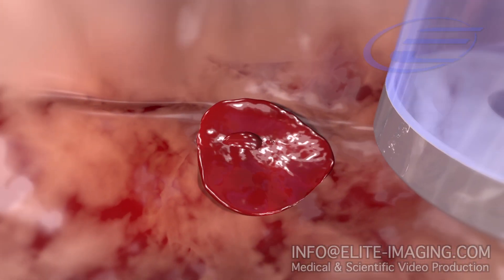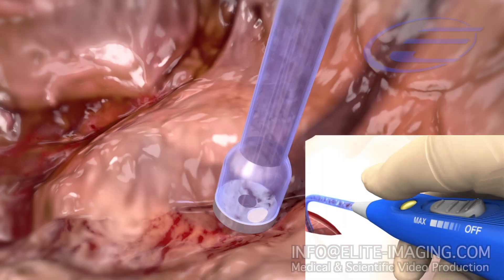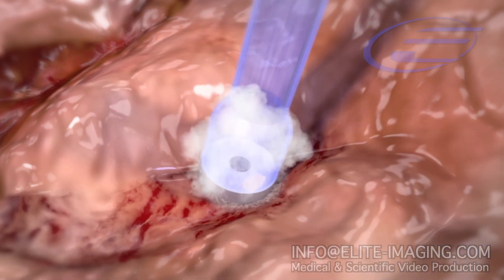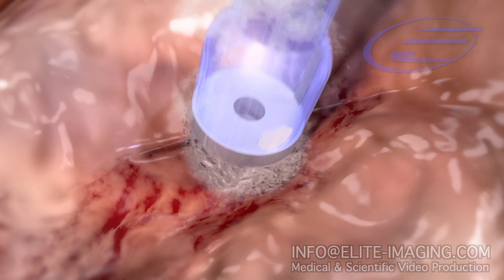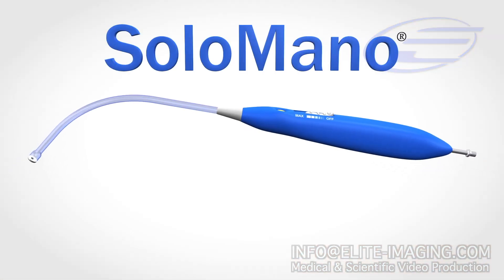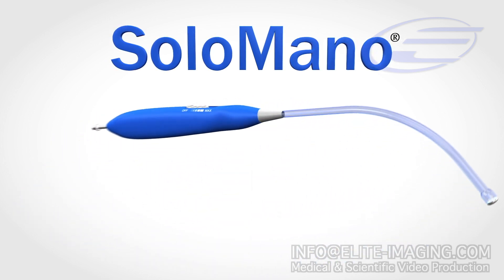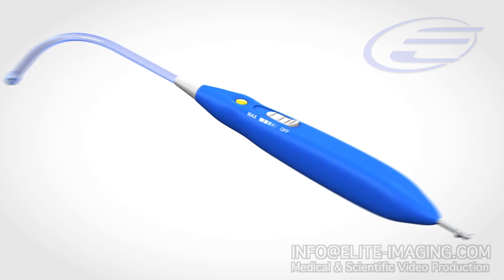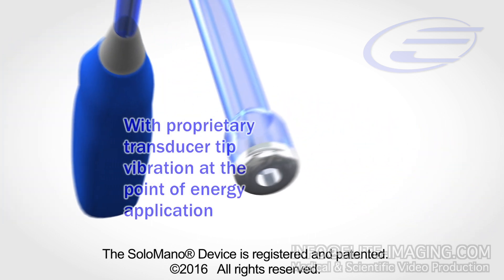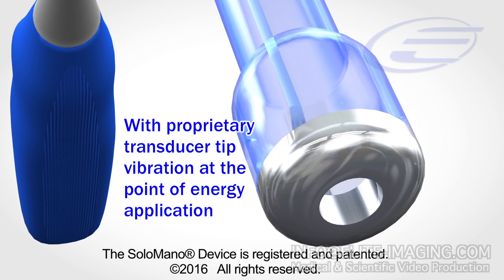The SoloMano transducer tip simultaneously applies energy and micro-motion to achieve cauterization and prevent tissue adherence. The SoloMano device ensures that a surgeon can single-handedly isolate and cauterize bleeding points during any open or minimally invasive surgical procedure. Seamless integration of blood evacuation with a proprietary low-cost disposable transducer tip allows for single-handed operation that prevents adherence of the cautery energy source to the tissue being cauterized.